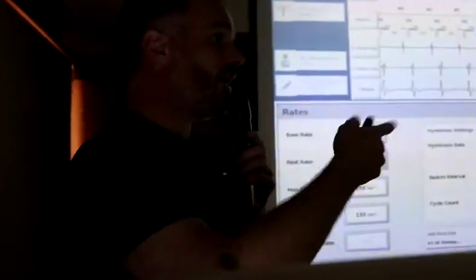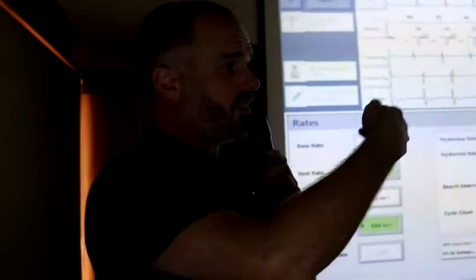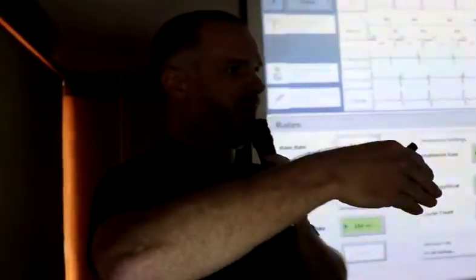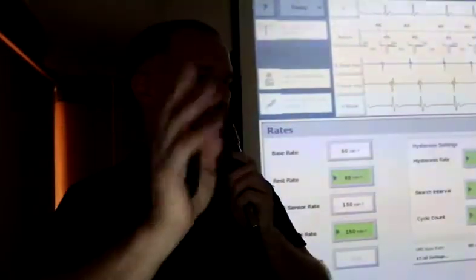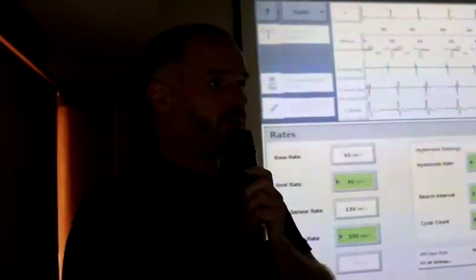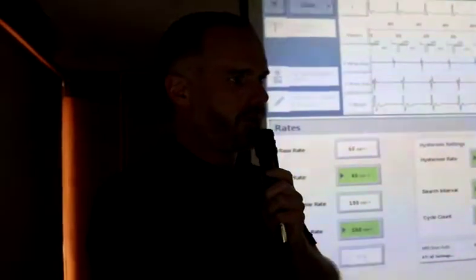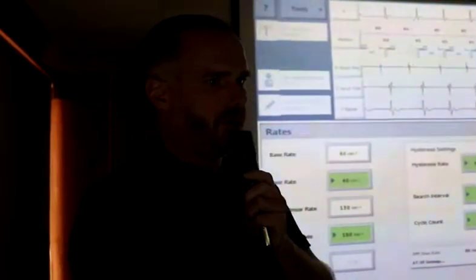How could you look at the sinus rate from the passive sensor? Well, we can get an idea from the diagnostics. We can tell what heart rate she's achieved. But for her, I'd go 220 minus 65, so whatever, 150-ish. Let it track up to about 150. Think about most 65-year-olds: they don't get heart rates much above this number in normal sinus rhythm.